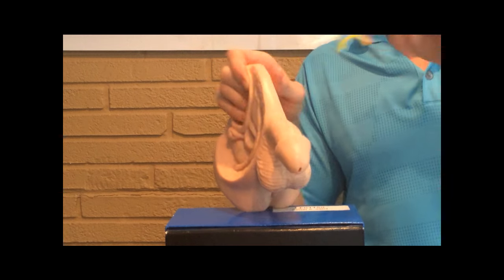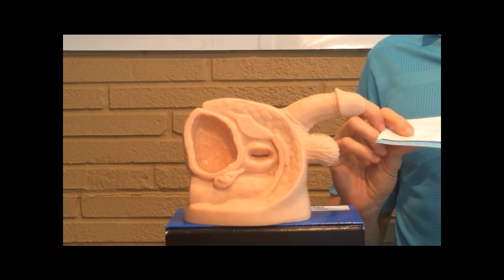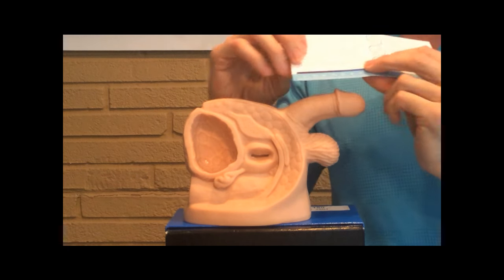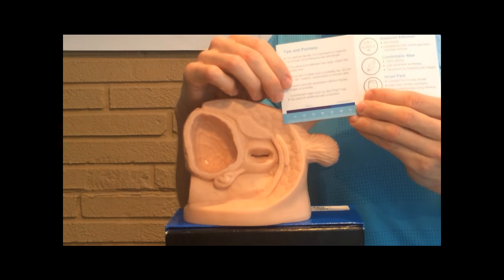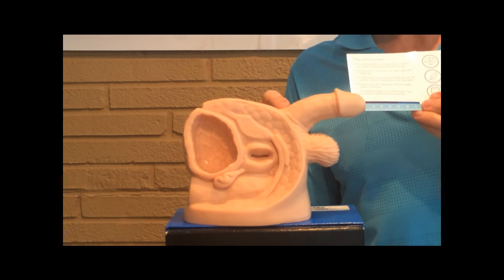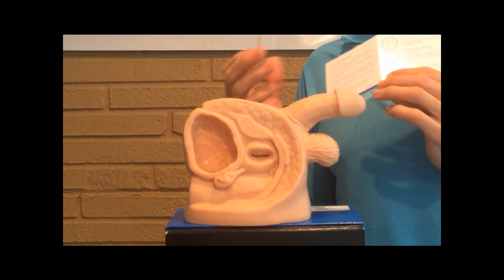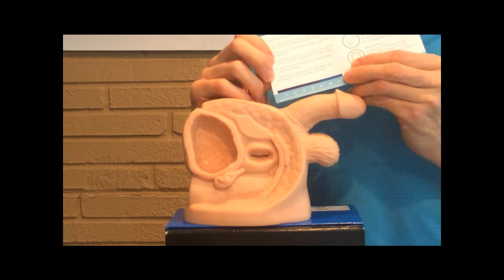Now that we've established the diameter, we want to figure out what length is appropriate. The Conveen Optima comes in two lengths: sport, which rhymes with short, and standard, which is the longer one. The standard has about two inches more than the sport. You want to make sure you use a sheath that has no excess once you roll it on. A lot of people will be fine with the sport; some people who want extra adhesive or have a longer penis will go with the standard. So Jimmy here is going to use the sport.